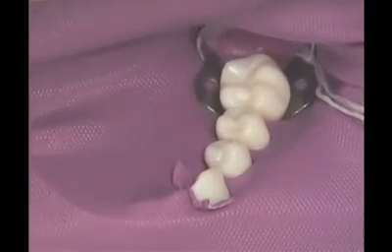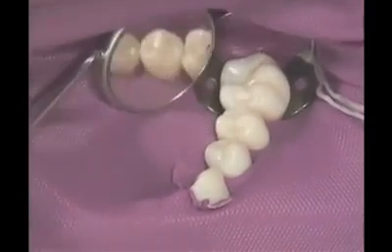When all punched holes are properly inverted, the dental dam application is complete.